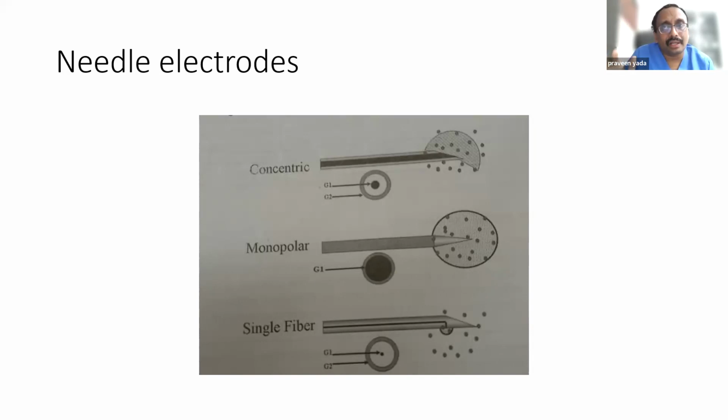Therefore, if you realize that the patient will not cooperate, try to make up your mind which muscle you would definitely like to see, right? For example, if it is a motor neuron disease and you can only put a needle in one muscle, I would go for the FDI. If it is a myopathy, I'll choose a proximal muscle. Ideally, they say that when you do an EMG, in each muscle, you have to check at 4 points. But in real life, it's not possible. In one muscle, once is enough.